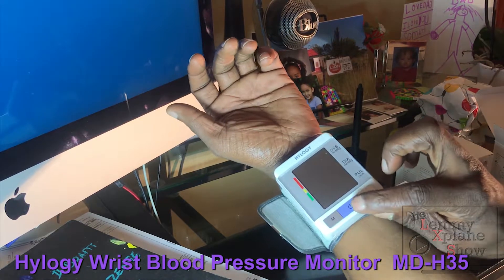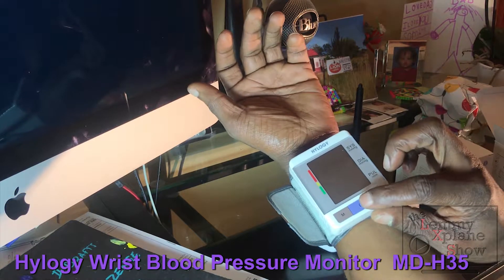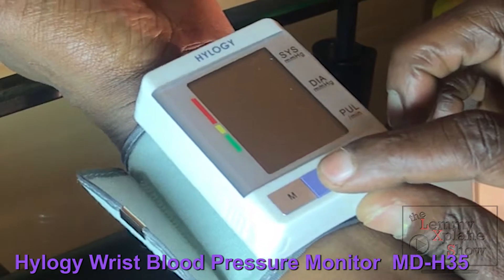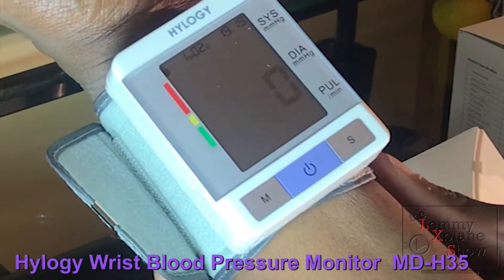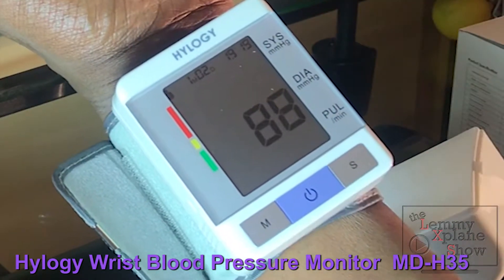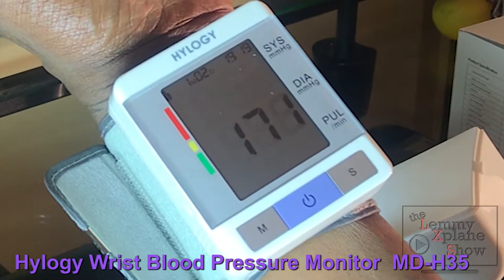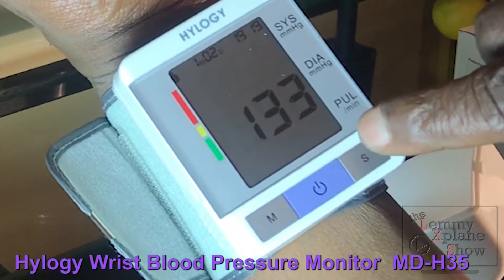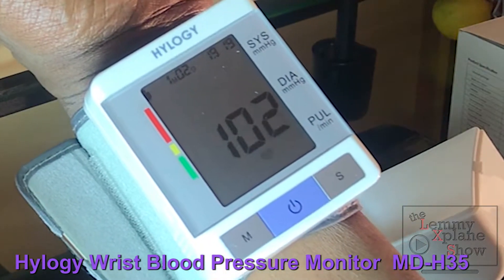For the sake of demonstration I'll tilt it slightly towards the camera so you can see what's going on. I'll press it to start. What happens is the zero flashes for a couple of seconds, then it begins to measure the blood pressure. Once the heart symbol starts flashing, it has detected a heart pulse.